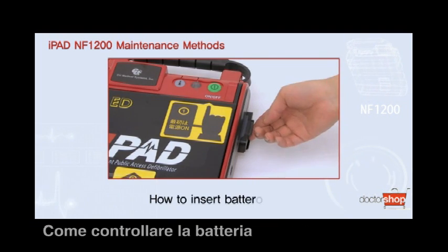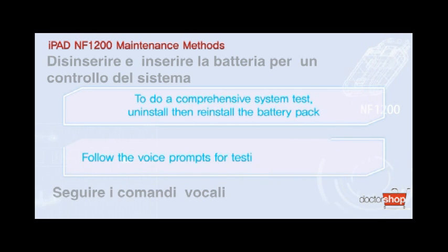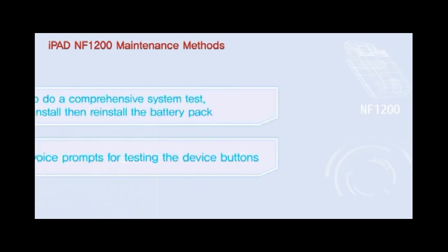How to insert the battery pack. To do a comprehensive system test, uninstall then reinstall the battery pack. Follow the voice prompts for testing the device buttons.